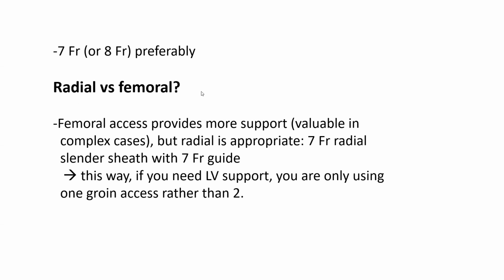Another question is radial versus femoral access. Femoral access provides more support, which is valuable in complex cases, and a lot of operators prefer femoral access in left main PCI. However, radial is appropriate, and I use it. In those cases, I would put a 7 French radial slender sheath with 7 French guide through it.